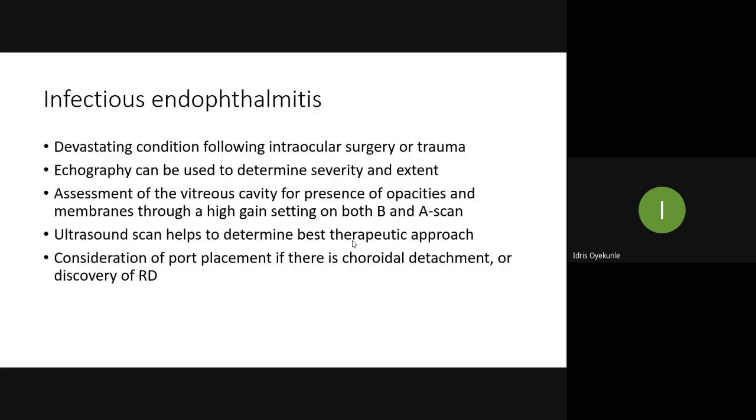Endophthalmitis is a devastating complication that can occur following trauma or intraocular surgery, and this scan is very important to determine severity and extent, and it also helps to determine the best therapeutic approach or even consideration for surgery. If you do this scan, you can see if it's just vitreous opacities or if there's RD or choroidal detachment, which will influence your management decision.